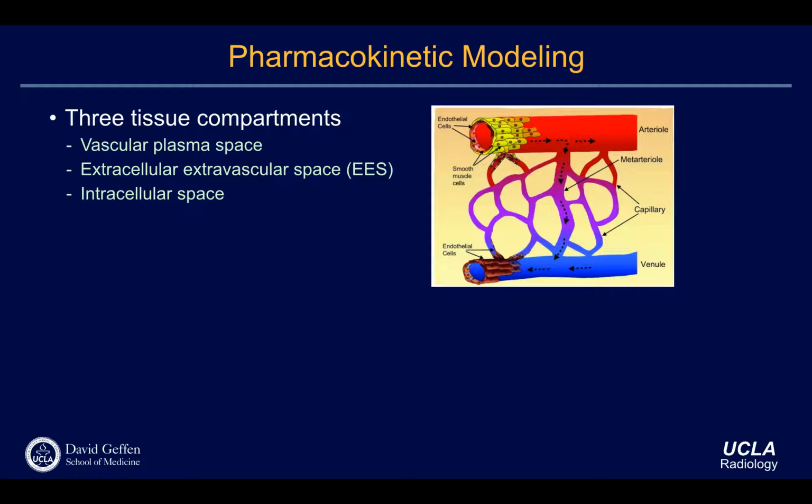So you inject the contrast agent, it goes into the artery and then going outside the tissue, and then at a certain time later, it goes back to the vein and then cleared out. Okay? So the way that we measure is how fast it goes outside the tissue and how fast it goes back to the vessel. Okay.